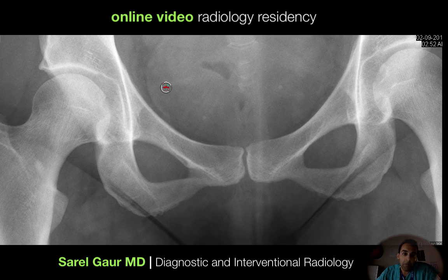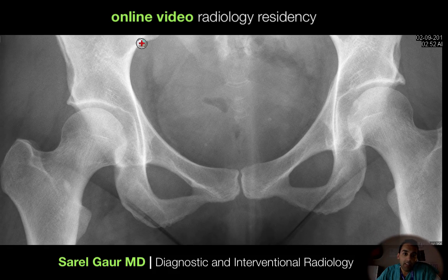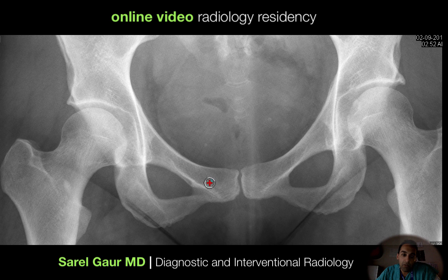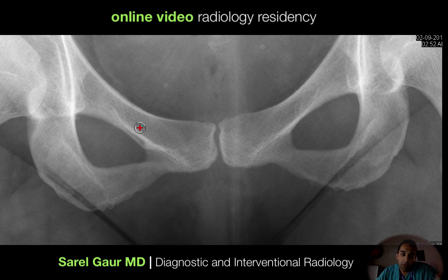There are some lines people use to help look for fractures. This is the iliopectineal line — a nice smooth curve — so if there's a disruption of this smooth curve, that can indicate a fracture of the superior pubic ramus. I also have the ilioischial line, which can be interrupted in the setting of an ischial fracture or maybe an inferior pubic ramus fracture.